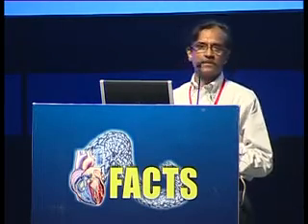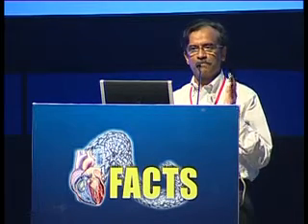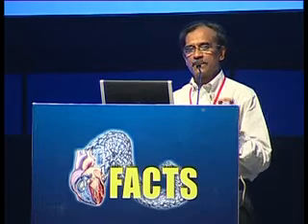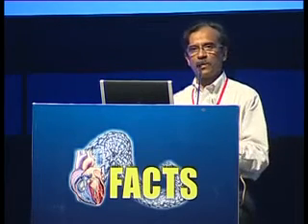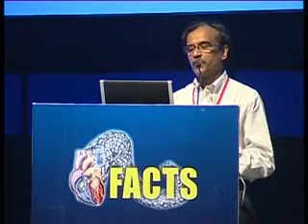Another difficulty, not unusual, is that we find resistance at the septum, especially if the transseptal puncture is inappropriate or at a lower level, or you have punctured the interatrial septum at the thicker portion.